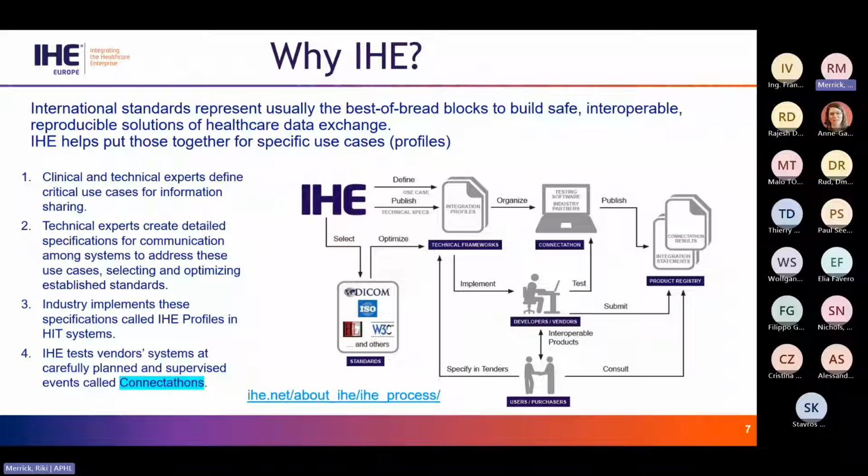Why do you use IHE? And hopefully you already know because you're attending, but IHE writes specifications that take existing standards and look at a specific use case and adopt the standards for that use case.